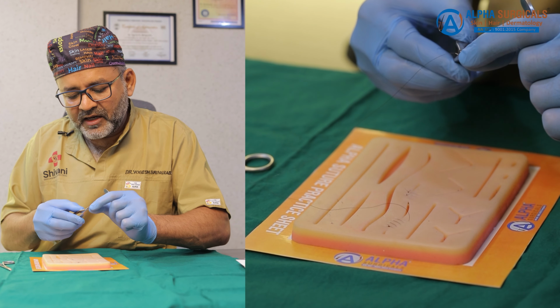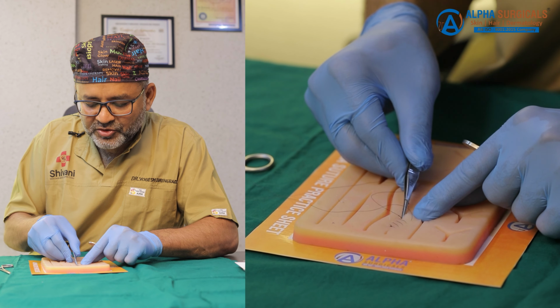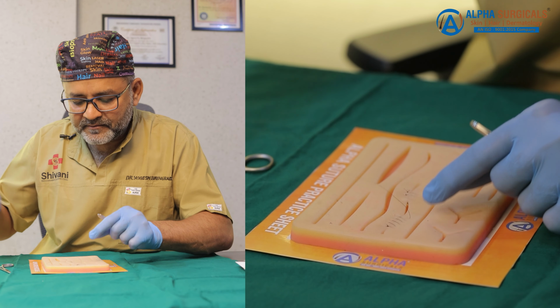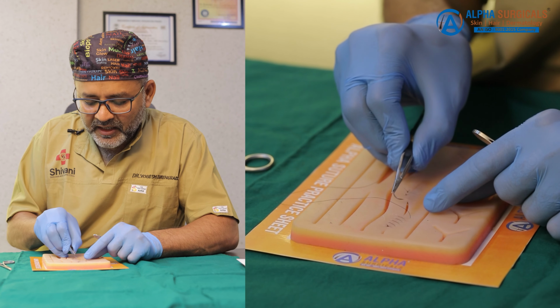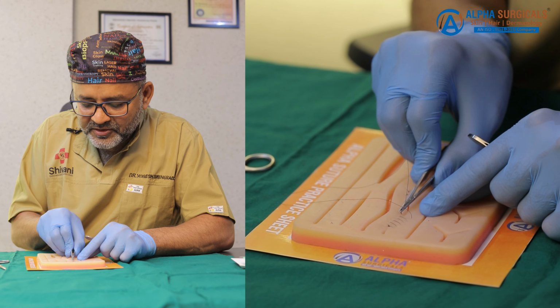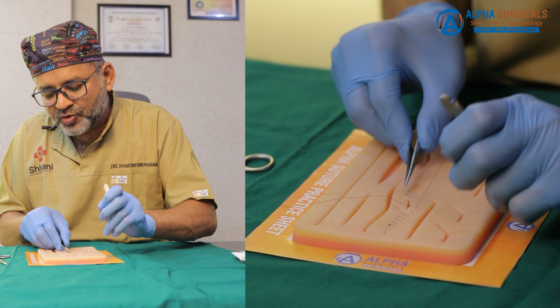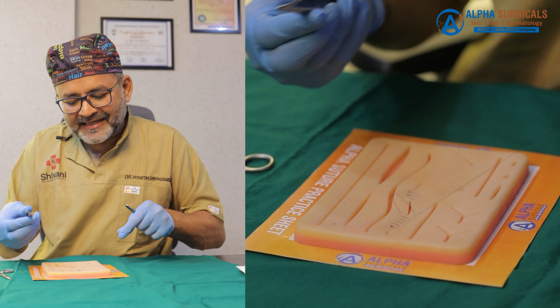When we are near the end of the second side, we have to stop and give the closure. So this will be my last prick of this running continuous suture. When we are supposed to close, the last loop will be used as a second end of the thread.